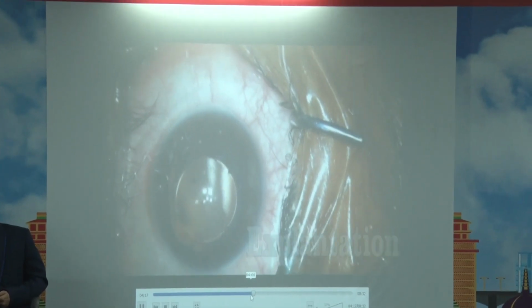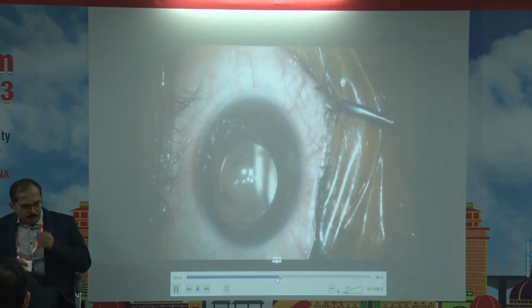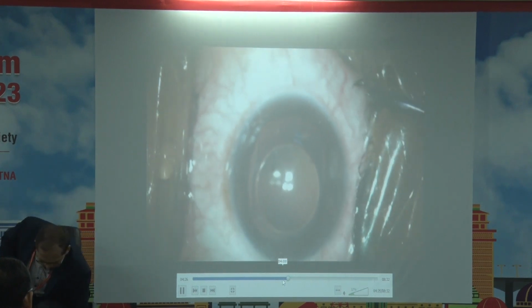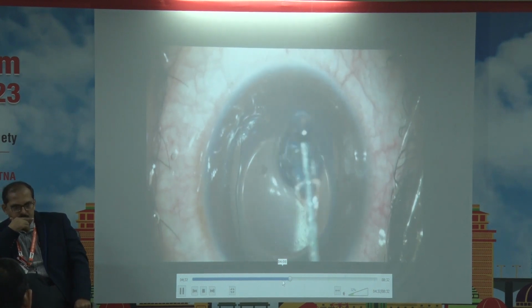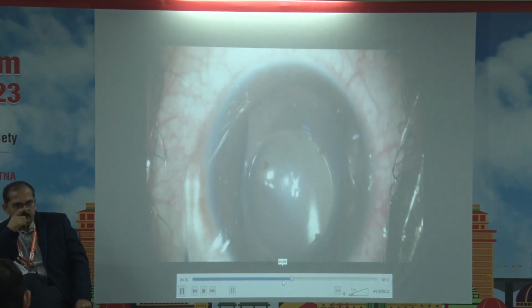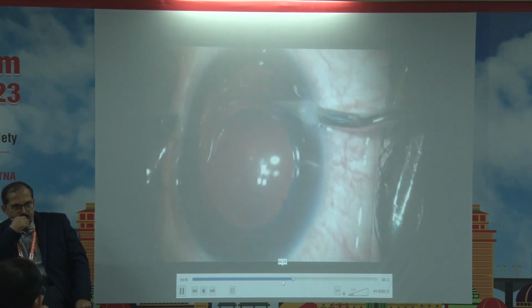This patient was a second eye and really developed a very bad inflammation post-surgery and also a rise in IOP, and the patient did not report to us for 2 days, thinking that the vomiting and all was because of something else. And as you can see, it ended up with a dilated fixed pupil, and we had to remove this phakic IOL.